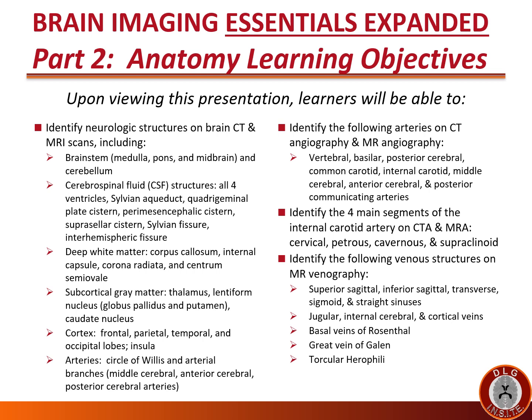sagittal, inferior sagittal, transverse, sigmoid, and straight sinuses, jugular, internal cerebral, and cortical veins, basal veins of Rosenthal, great vein of Galen, and the torcular herophili.